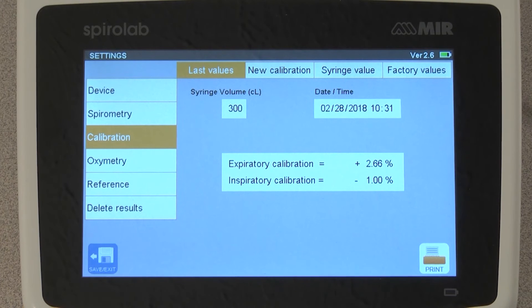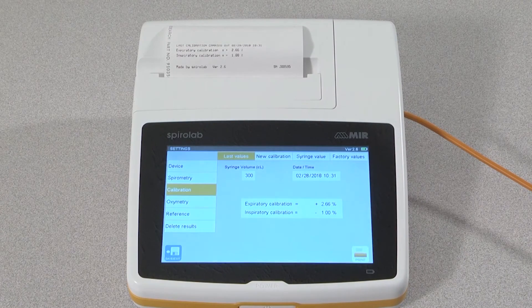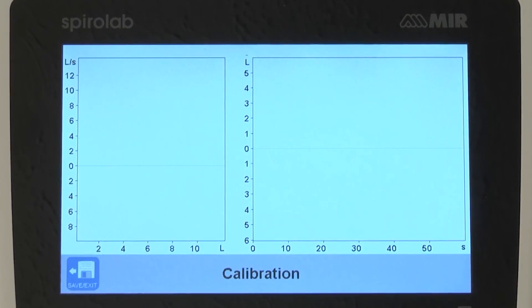You can print out the calibration check report by tapping the print icon in the lower right corner and insert the results into your file. If the results are outside the plus or minus 3% range, then repeat the test for a second time by restoring factory values and doing a new calibration. Always check to be sure that you have a tight seal and that no air is leaking at the syringe and the turbine.